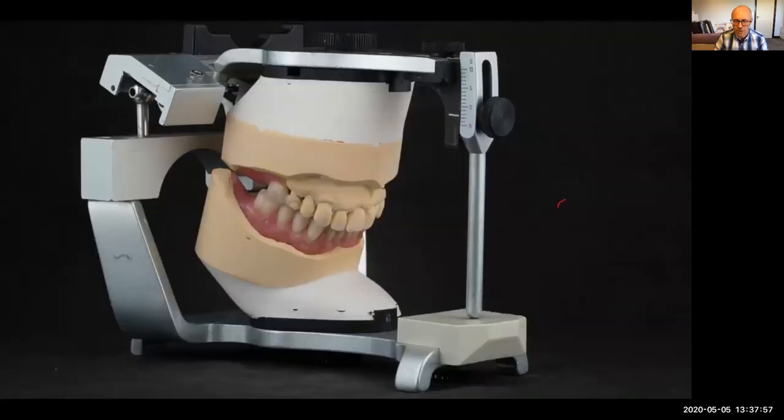So, that means we can then set all of the teeth up, and we've got the patient's head on the bench like that. And then Rowan can just do that. But look at the actual denture there. I'll explore this a little bit more in a minute. So we've got this clasp that just comes around there. That's a dental D clasp, and it's a metal-based upper denture and a full lower.